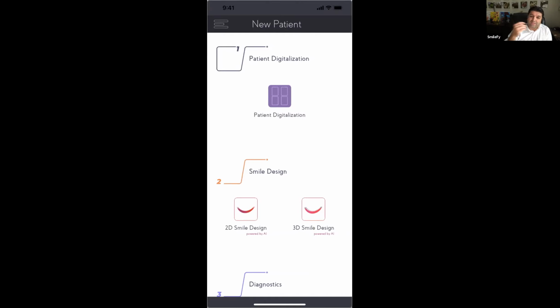So it doesn't matter. The vision of the technology that we have created is to have something that works all the time on the desktop, on the iPhone, on the iPad. It's the same features, same workflows, and you can have fun whatever device you use, right?